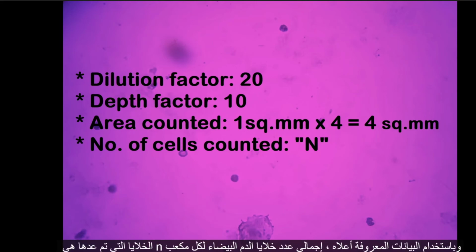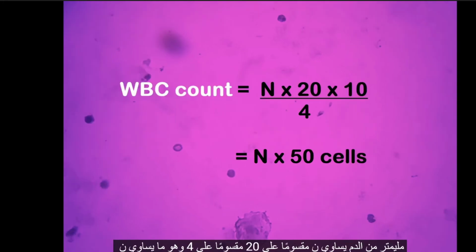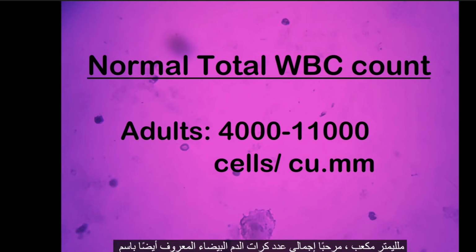Assuming that the number of cells counted is n and using the above known data, the total WBC count per cubic millimeter of blood equals n × 20 × 10 divided by 4, which equals n × 50. Normal total WBC count in adults ranges from 4,000 to 11,000 cells per cubic millimeter.